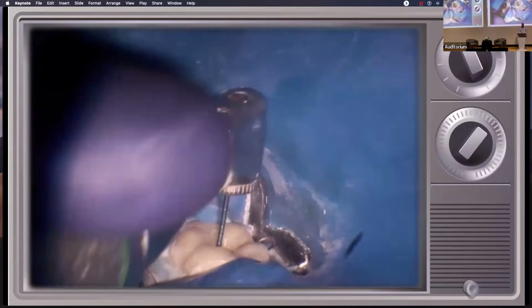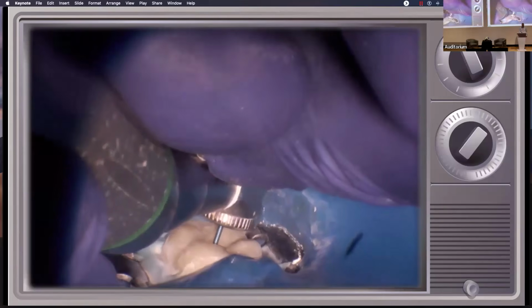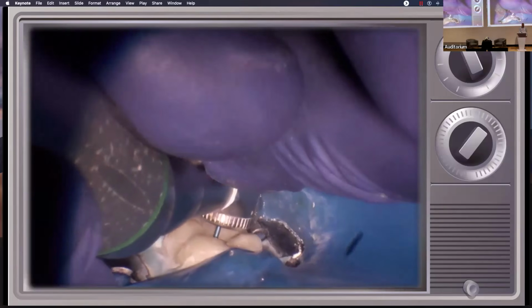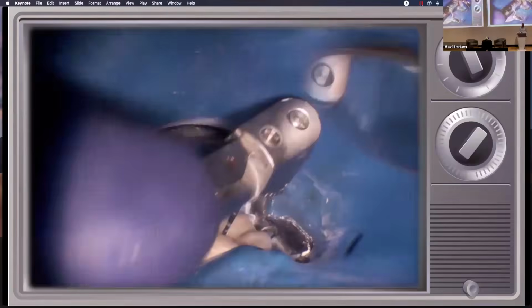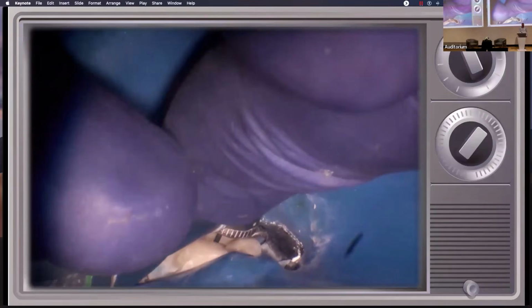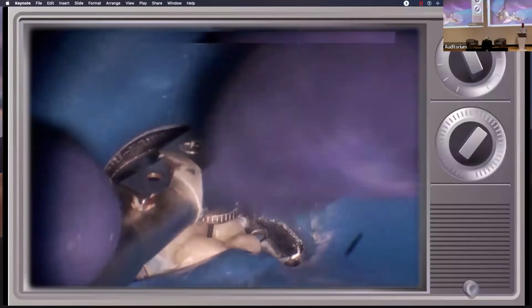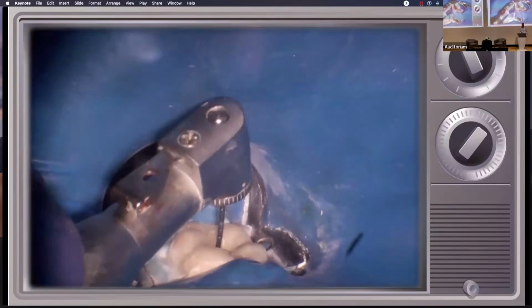Placement bend into the MB. There's 22, 23, 24. First try. In the distal, there's DB. The DB's got a little curve on the end, so if it goes, great, and if not, that's okay too. You just seem to quite want to go around that little distal hook. And here's the DL.